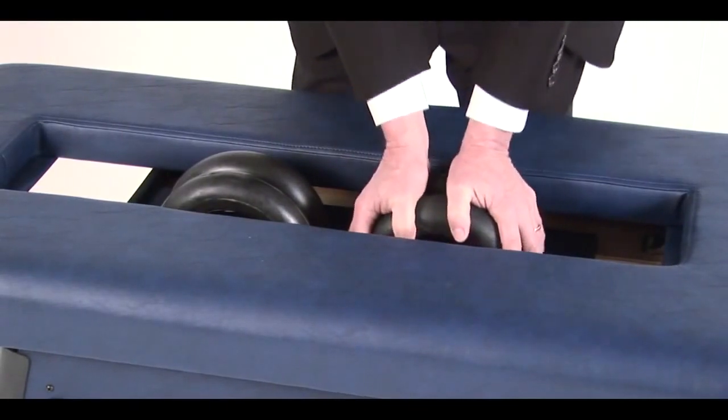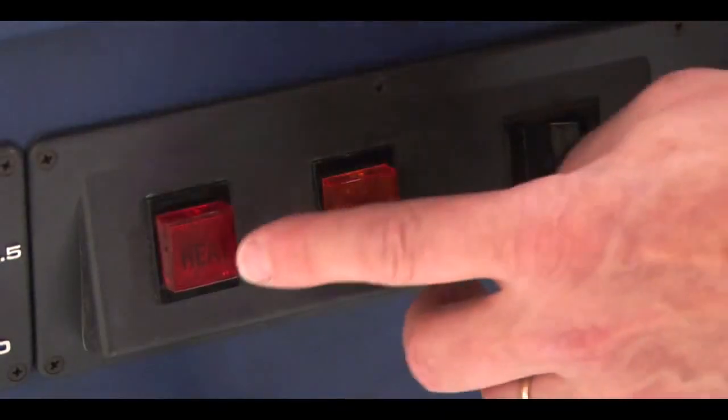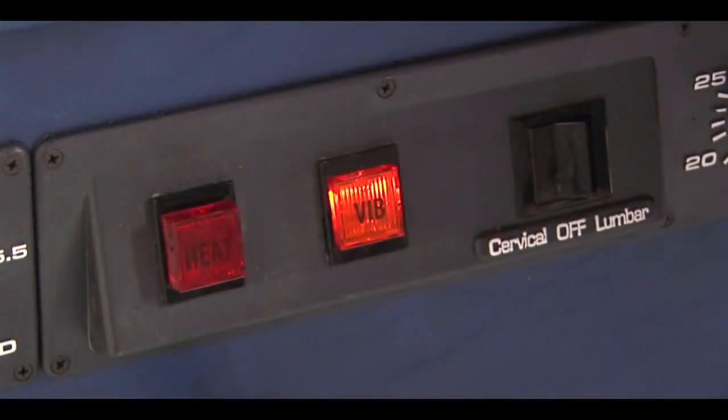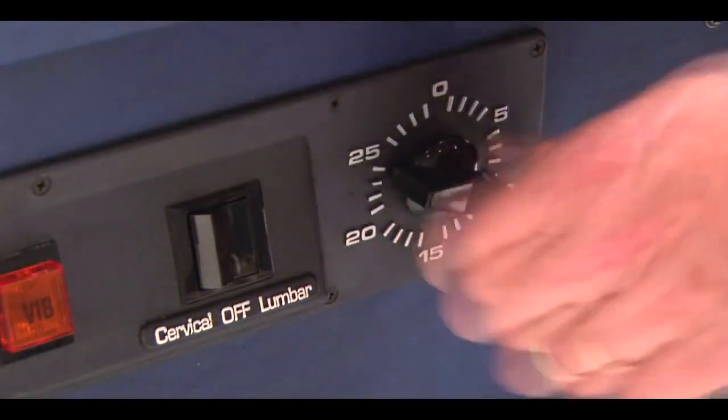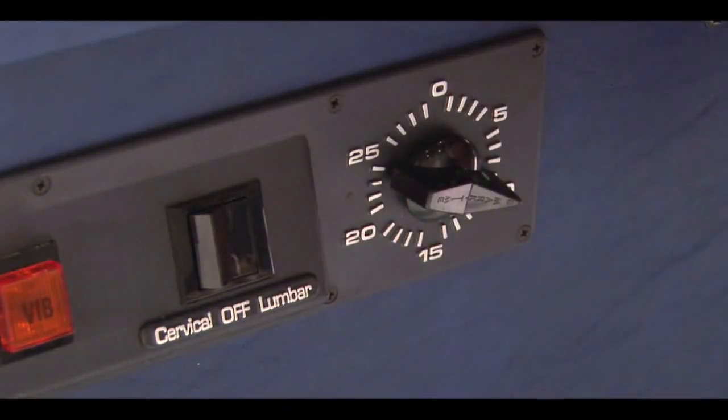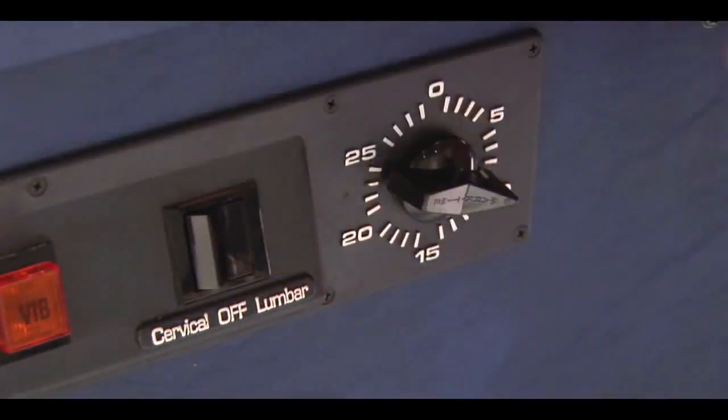The Anatomotor is easy to operate. For heat, just press the red switch. To turn on the vibration, push the yellow switch. To start the table, select the desired treatment time, usually between 7 to 10 minutes, and set the switch to either the cervical or lumbar position.